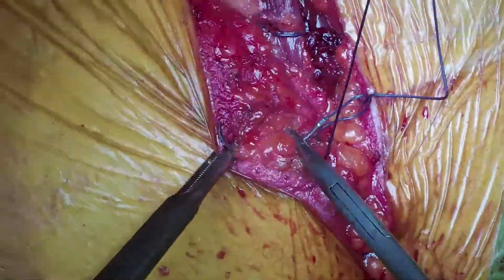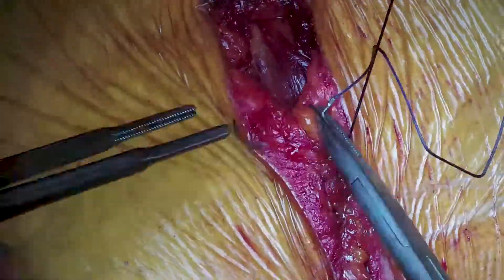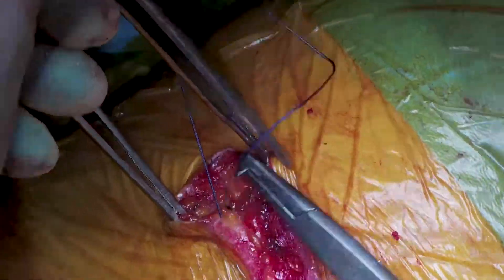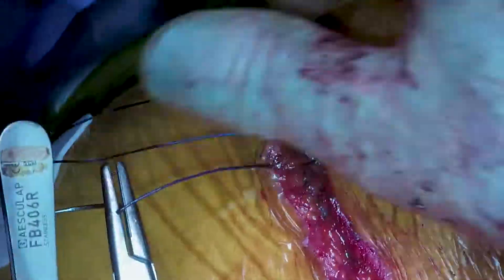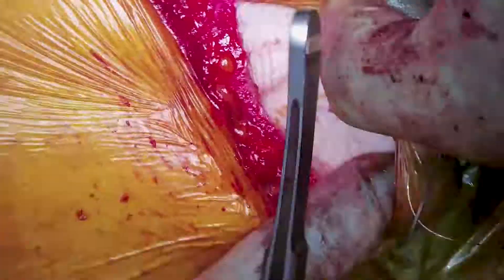To summarise the key points across both videos, all related to reducing post-operative pain and improving surgical technique: we spent time undermining the latissimus dorsi to avoid cutting it, leading to quicker recovery; we performed an intercostal strip to prevent the nerve being crushed by the retractor; we did intercostal blocks to help with post-operative pain; and we used a sub-xiphoid incision for the staple gun and chest drain throughout, as this site causes less post-operative pain. By doing all of this, outcomes are improved and morbidity is reduced in these patients.